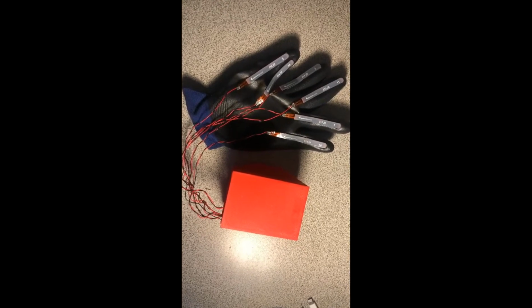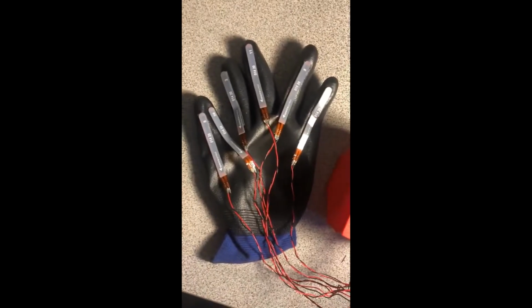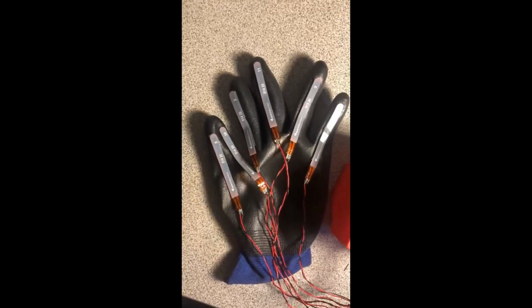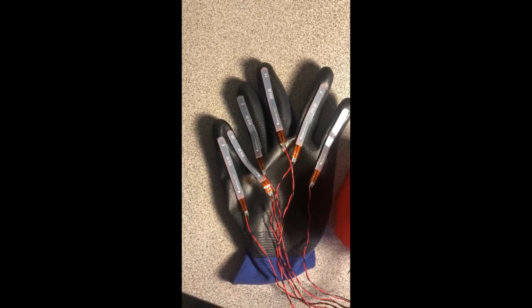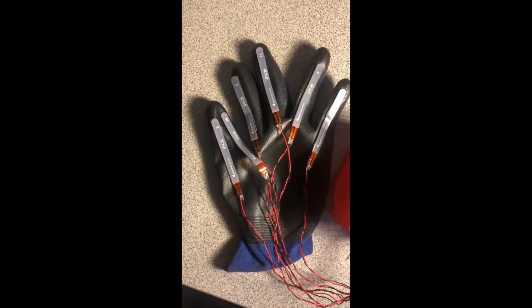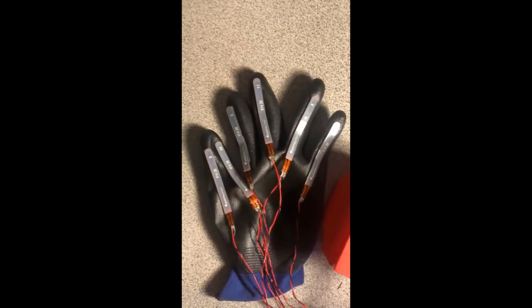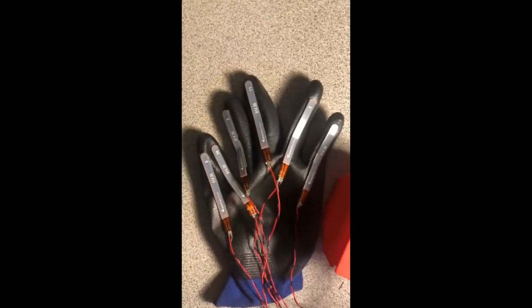Here is the flex sensor prototype, and as you can see, this glove right here has 6 sensors on it, which are able to capture the bending of the fingers. Especially, there are 2 flex sensors on the thumb, which allow us to measure the bending angle in 2 dimensions. Normally, they report 180 degrees, but when you bend the angle down, the reported data goes down, and in the opposite direction, when bending the angle up, the reported data should be above 180.